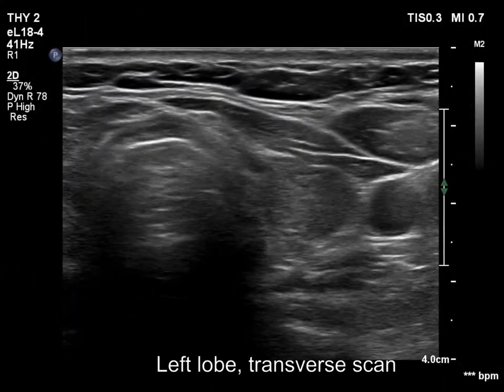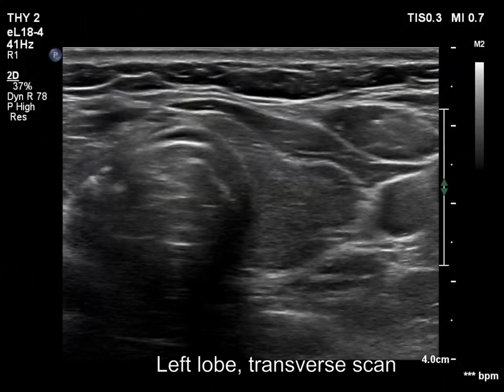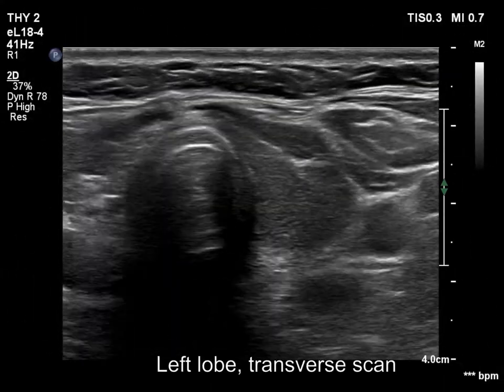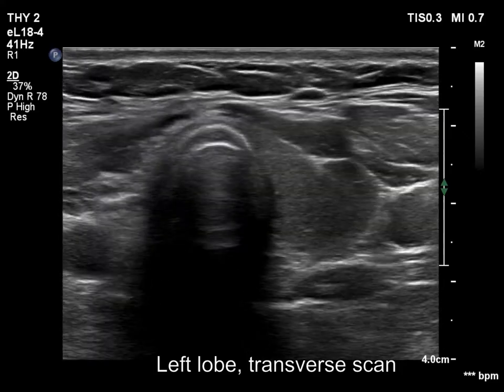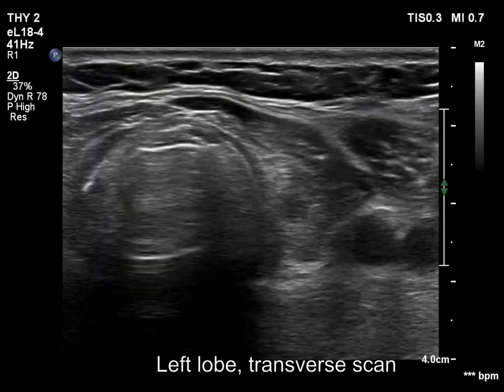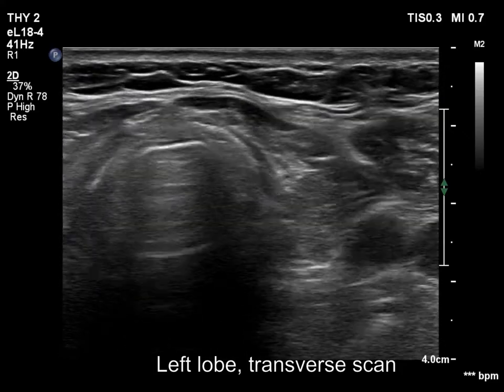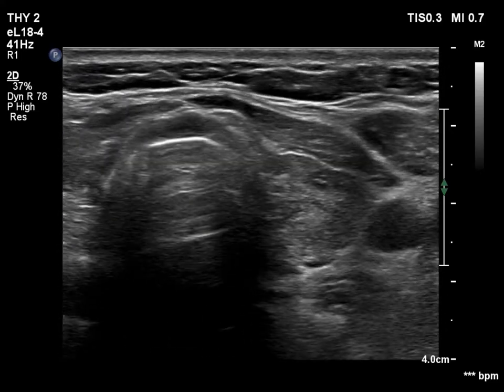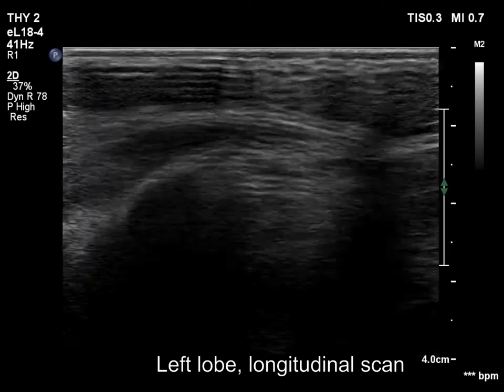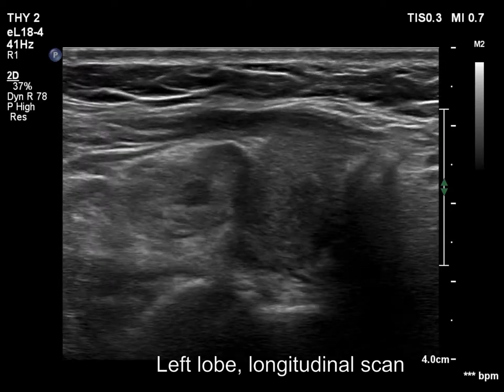Compared with the former examination, the left lobe became larger. It is moderately hypoechoic. Connective tissue divides the lobe into two parts.